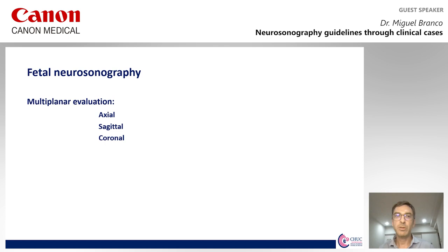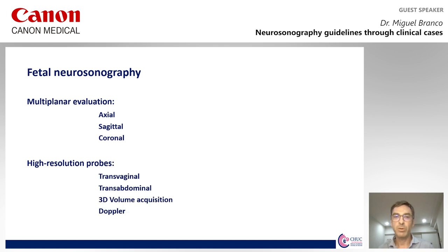Fetal neurosonography is a multiplanar evaluation. We should always start with a complete axial evaluation, which is complemented by sagittal and coronal evaluation. We depend on high resolution probes with transvaginal and transabdominal approach. 3D volume acquisition may prove very helpful. Doppler evaluation has limited value in this field.